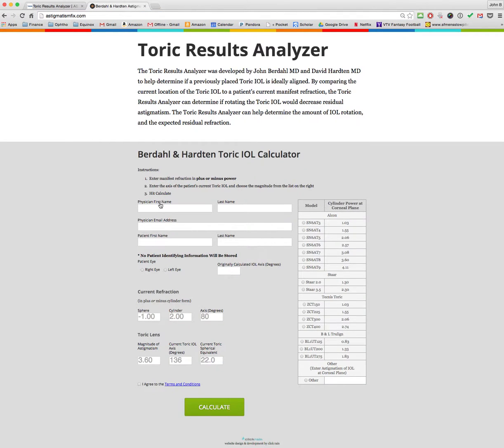As you're using the website, remember the goal is: if you have a patient that has residual astigmatism after having a toric lens placed, this website can help calculate the ideal position that toric lens should be in, and help you determine if you should rotate that IOL, exchange that IOL, or perform laser vision correction.